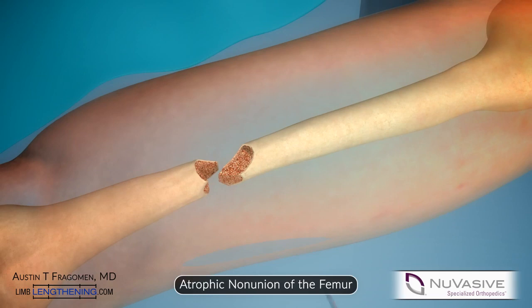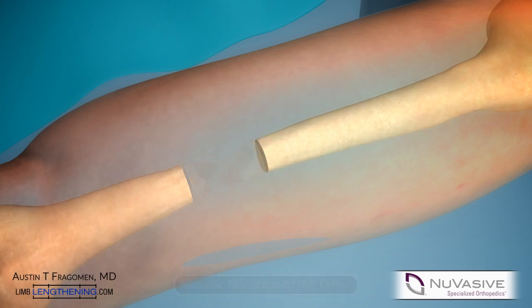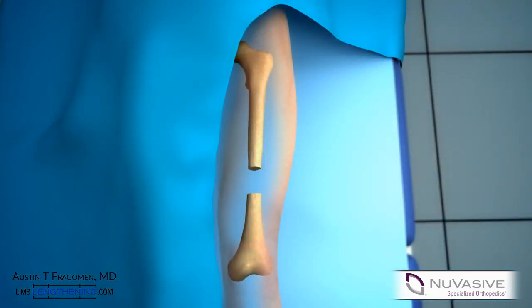This schematic represents an atrophic non-union of the femur. The schematic shows an open debridement of the bone ends down to viable bone. In this case, the bone ends were able to be acutely shortened.